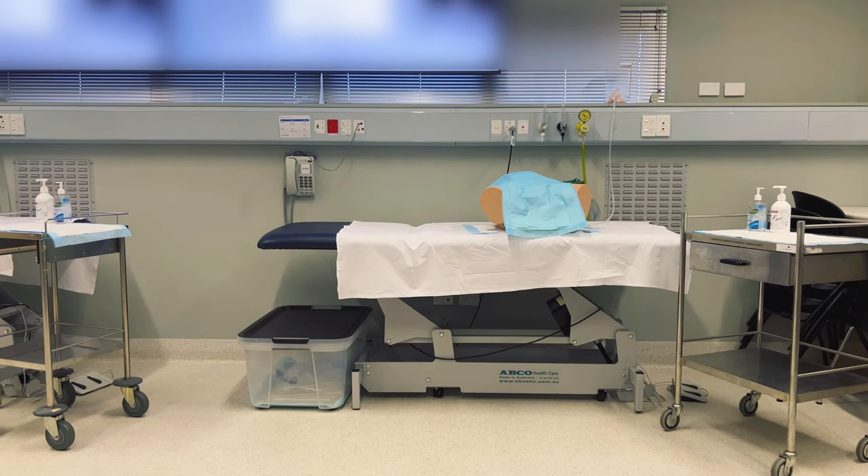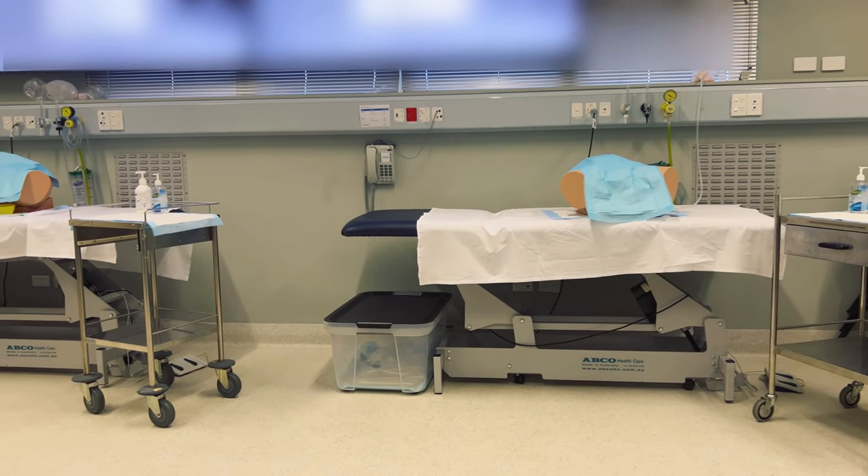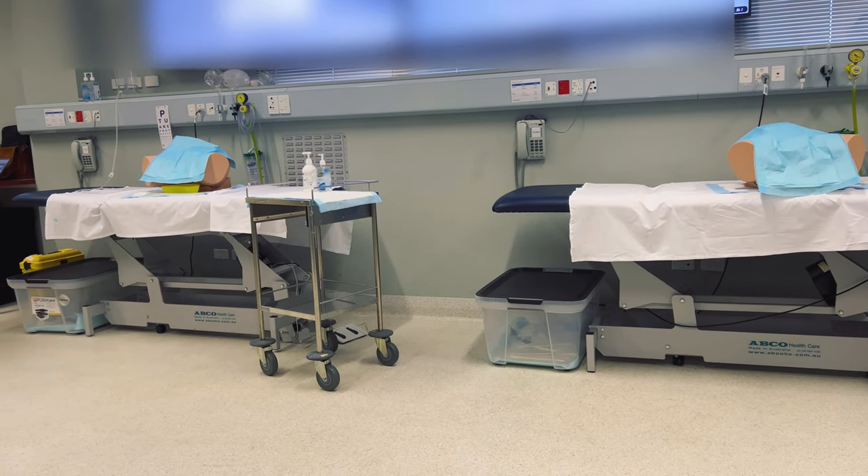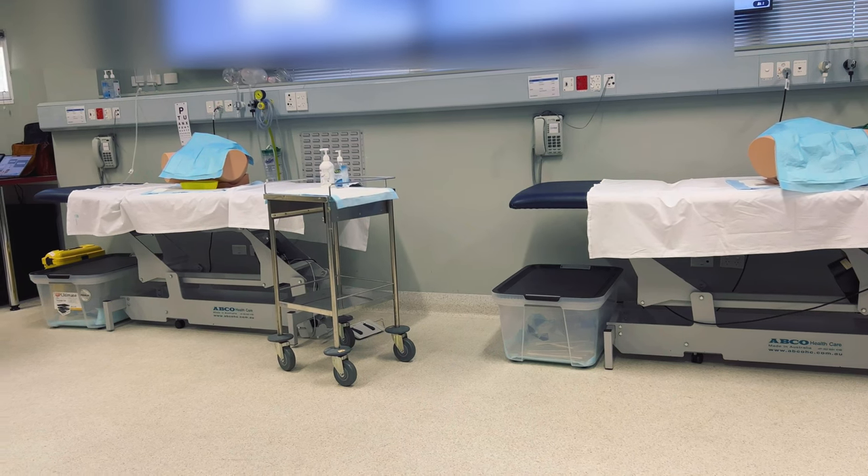I really wanted to trial the male one today because I heard it was more difficult and I wanted to practice my skills. But it was rather popular for that reason, so I ended up practicing on the female model instead.